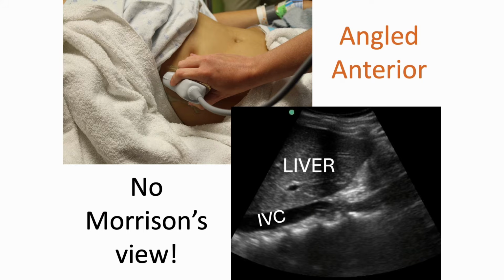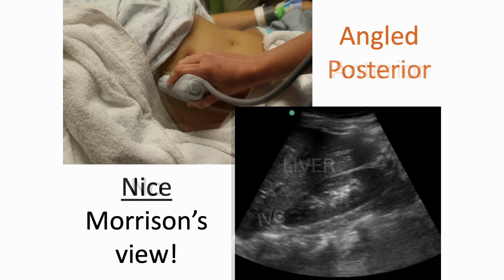An important trick to this exam is to recognize that you're looking at a retroperitoneal structure, the kidney. With that in mind, if you angle your probe only intra-abdominally, you won't see the kidney. You'll see bowel gas, or in this case, the IVC. How can you address this? Well, you can angle the probe more posteriorly. By angling the probe towards the patient's back, you can establish a clear right upper quadrant view that includes Morrison's pouch. Again, if you don't see Morrison's, angle the probe toward the patient's back.